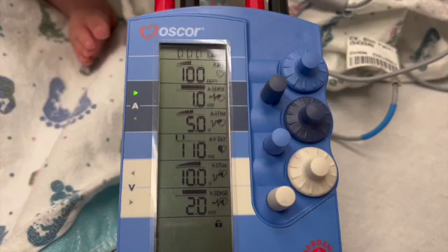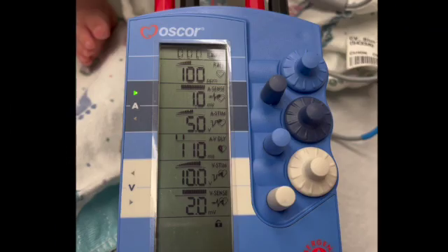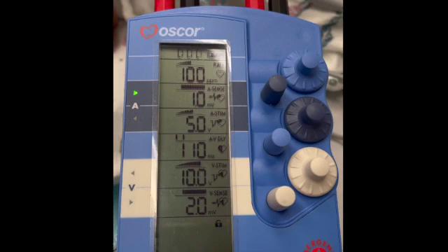So let's talk about the knobs. Remembering your pacemaker may be different, but should have the same functionality. At the top, we have rate. This is the slowest the pacemaker will pace your patient. And if they have no electrical activity at all, this is what the pacemaker will pace at. When you are setting a rate, you are really telling the pacemaker how long to listen for an electrical signal from the heart before it paces.